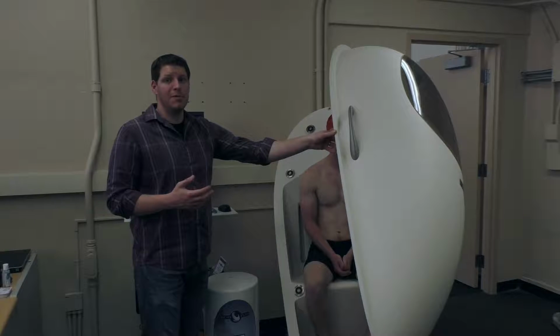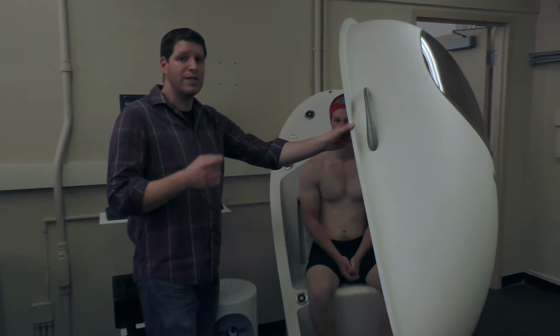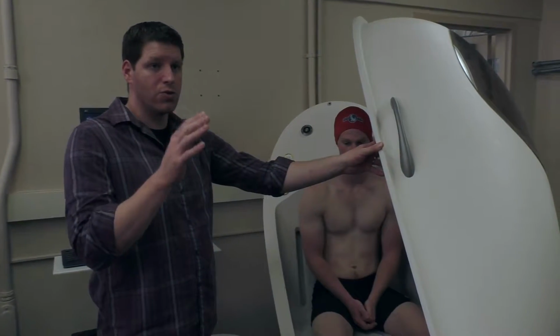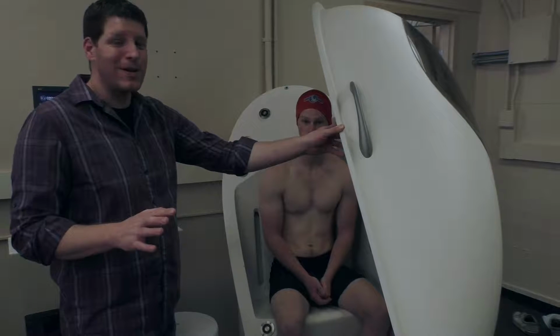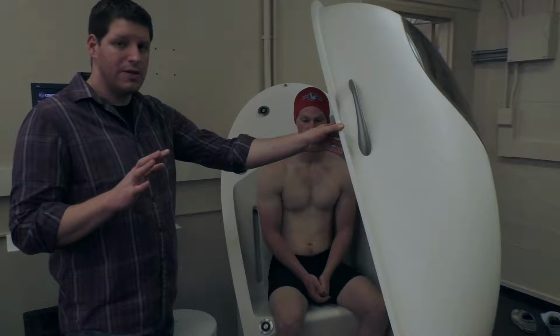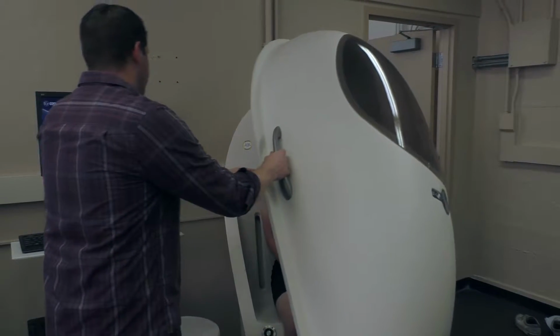Now, it doesn't mean deep, deep breaths. It means sort of shallow breaths. But the key is that they hold as still as they possibly can. They need to look straight forward. They can't move their head, no smiling or laughing or anything to that nature. The key is to hold as still as they possibly can. Okay? Ready to go? Okay, hold still.